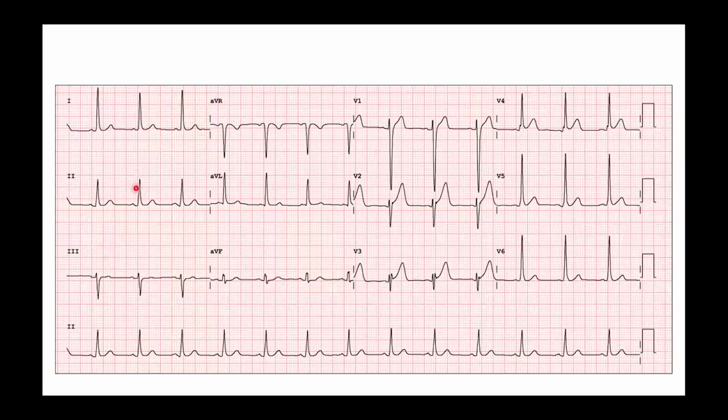But in those patients, the Q wave in lead 1 will be present. Here you should take into consideration the presence of a small R and deep S in lead 3 along with the absence of a Q wave in lead 1. Both things should be there.